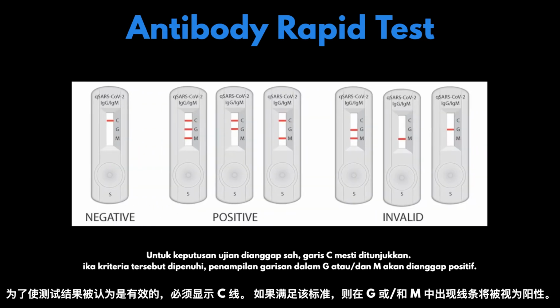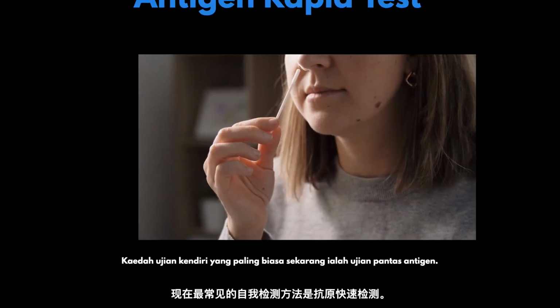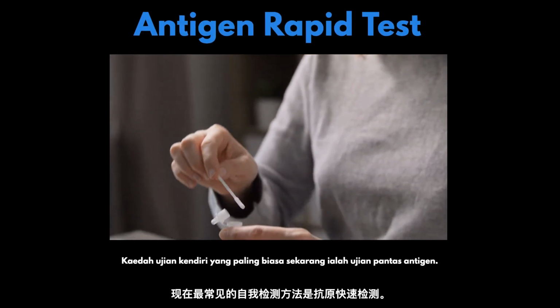For the test results to be considered valid, the C line must be shown. If that criteria is fulfilled, the appearance of line in G or M will be considered positive. As this method requires blood sample and the accuracy is not much higher than the convenient antigen test, this method has been slowly replaced. The most common self-testing method is the antigen rapid test.